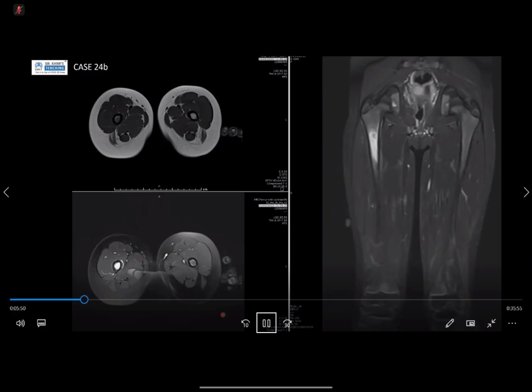No, I can't think. Okay, so are you quite confident? Are you going to tell them that's it, we're going to leave it alone, we're not going to do anything more, or are you going to say, I want to do more? You can choose to repeat imaging. You can choose to do another scan, a different modality. What will you do next? I would like to do a CT scan of this.